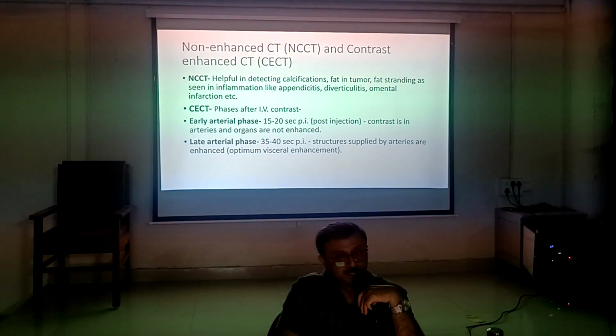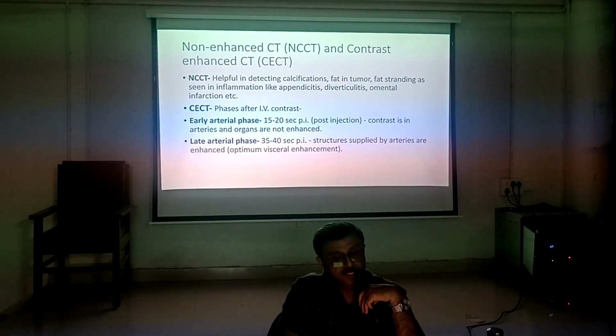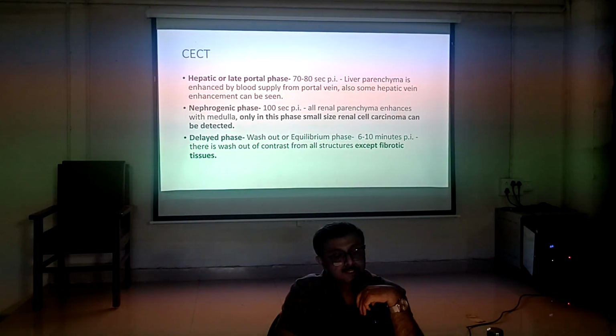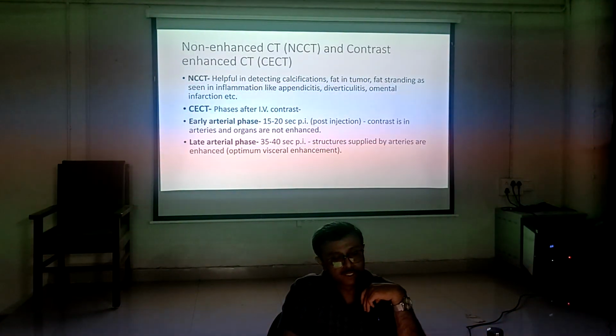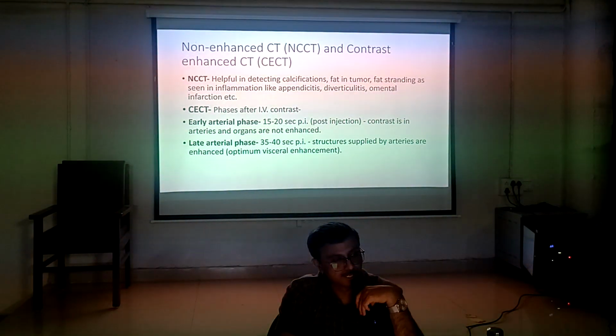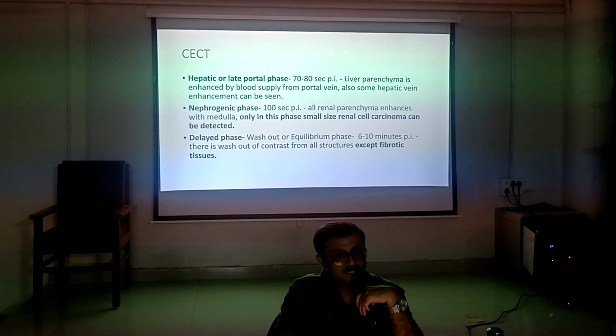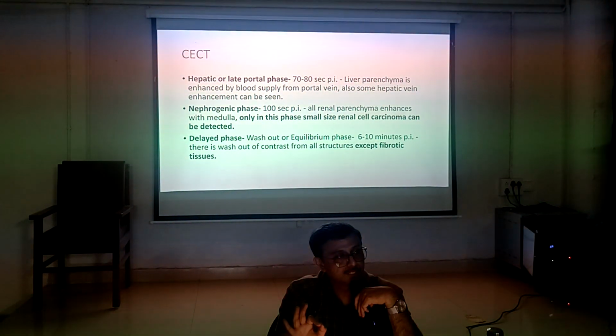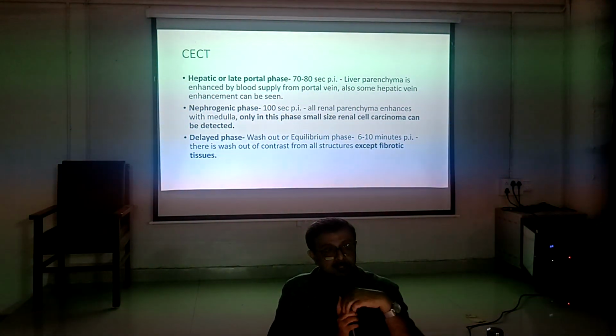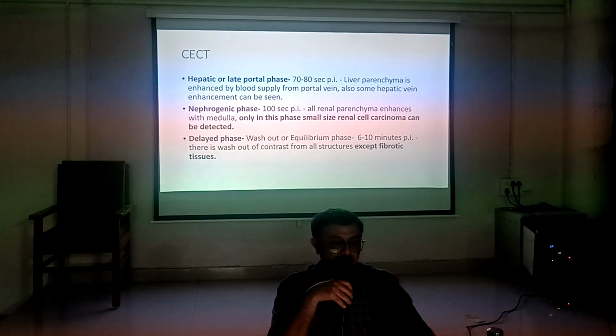Non-contrast and contrast enhanced. If it is contrast enhanced: early arterial phase, late arterial phase, hepatic or late portal phase, nephrogenic phase, delayed phase. Usually, if it is the liver, early arterial phase, late arterial phase, portal phase, and then delayed. Otherwise early arterial, late arterial, delayed. We inject the dye, and there are 3 phases.